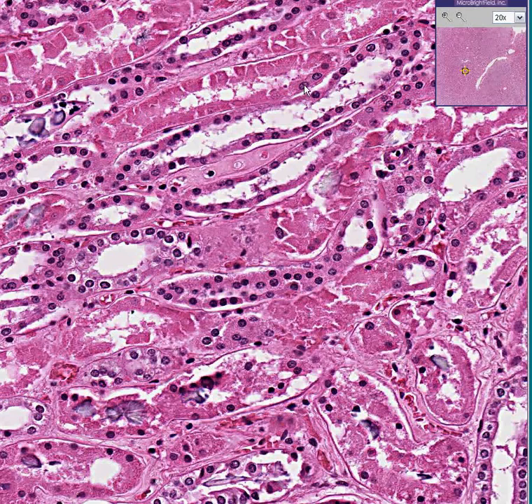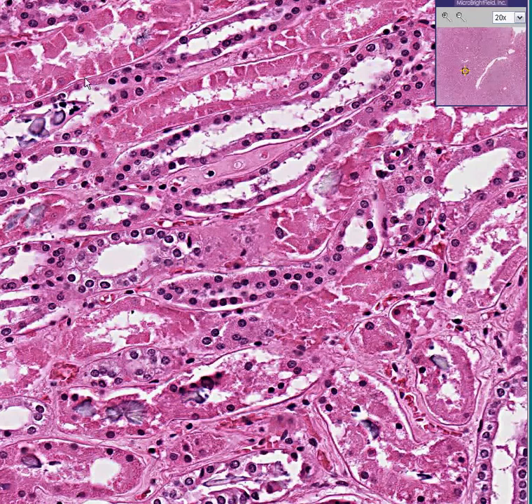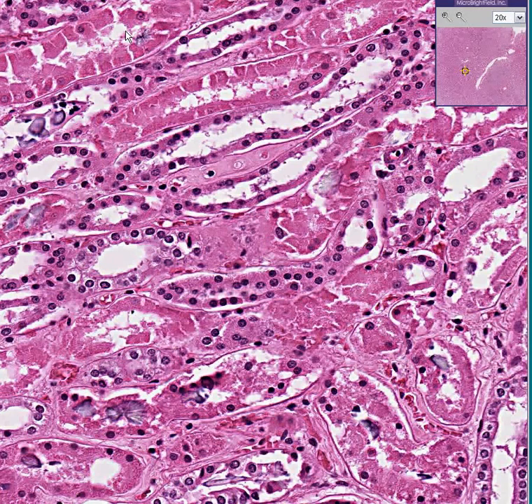The cytoplasm is a lot redder than it should be — these are necrotic tubules as well. Here is a part of the tubule where you can at least see some residual cells, but almost all of this tubule and almost all of this one is also necrotic. This is tubular necrosis. Tubular necrosis has a very long list of differential diagnoses, many of which are vascular and many of which are toxic.